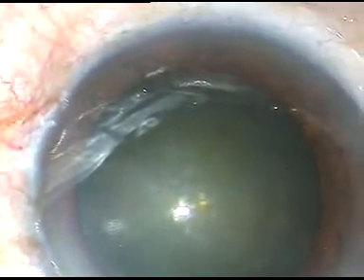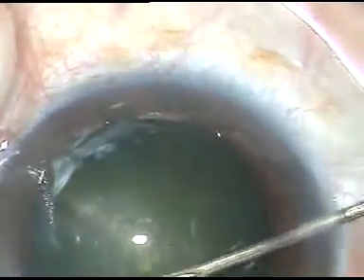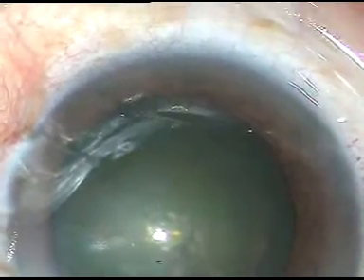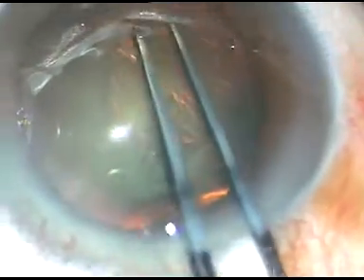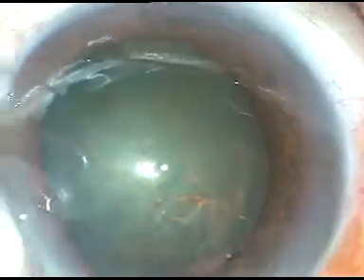Capsular rhexis is to be done. I incise the capsule with a 26-gauge bent needle and raise a capsular flap, which is easy to hold with utrata forceps. I then use the utrata forceps, go anti-clockwise and do the rhexis. I don't hold the eyeball with any tooth forceps — just support with a cotton-tipped Jensen bud. The rhexis is done. This is a continuous curvilinear capsulorrhexis.